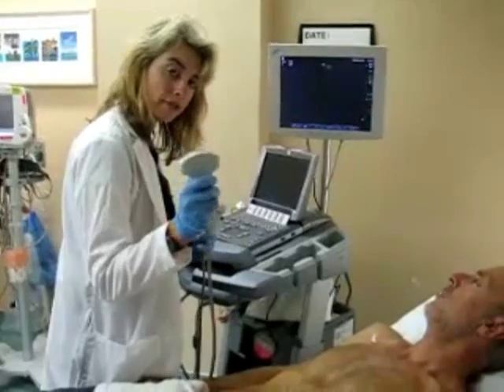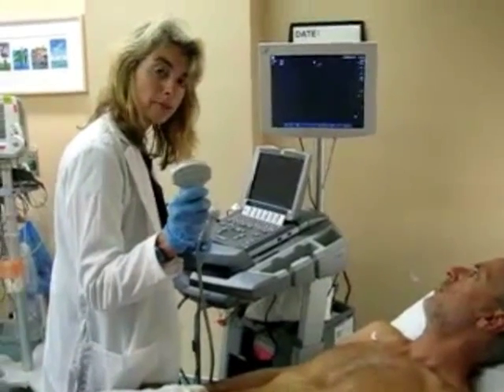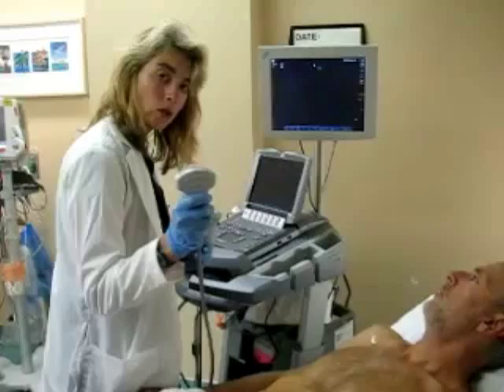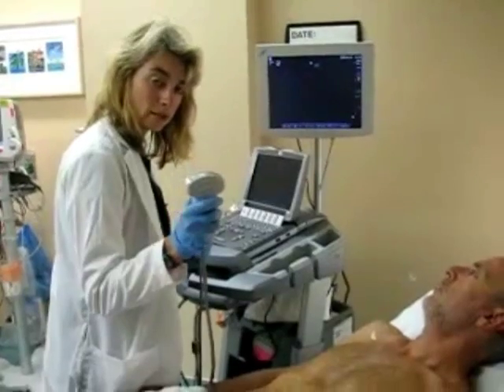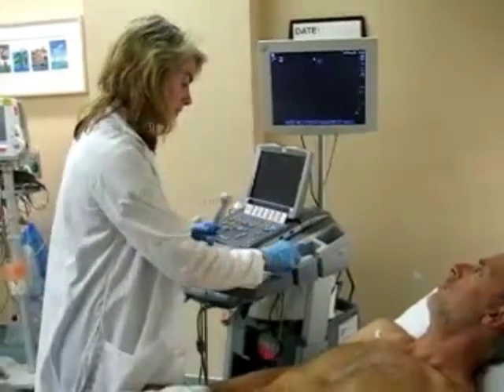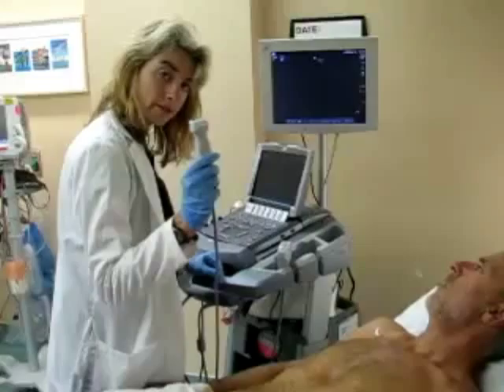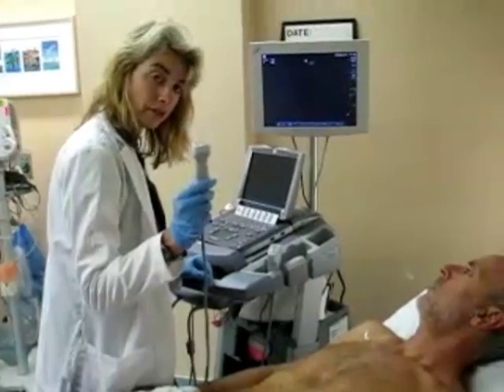This is a very useful probe in patients who have a more generous body habitus, where the pannus needs to be squeezed out of the way. In smaller, thinner patients, this is just as good.